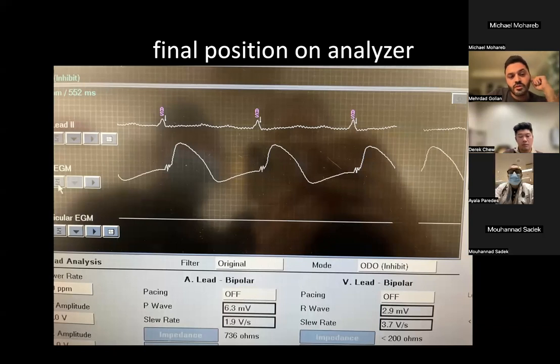But usually the filters are not quite set up to get on the analyzer a His or LBB potential. What I observed a lot of times is you have a huge injury current, but you have this small kind of QRS at the beginning.